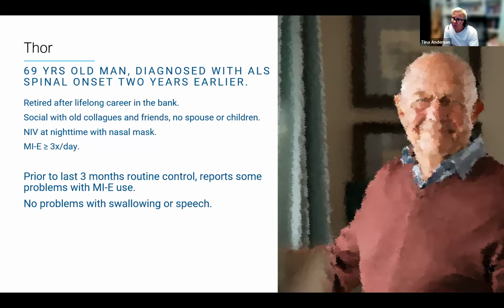Before we see Thor again, it's a routine control every third month. He gives us word that he has some problems with his MIE device. It's not working as well as it did when we started. And we asked him on the phone, but do you have any problems to speak or swallow? He said, no, nothing, just the cough machine, cough device. That's a little bit problematic.